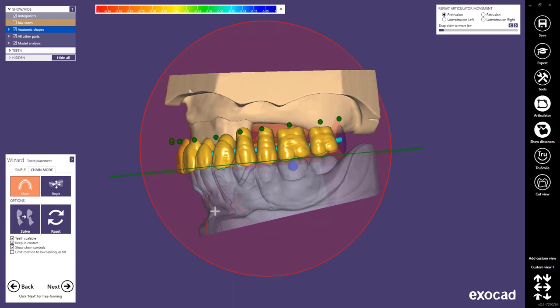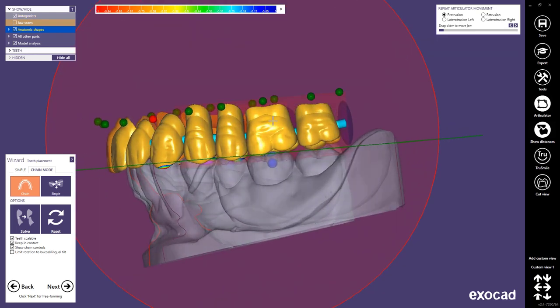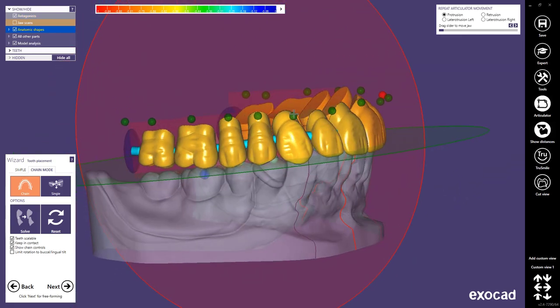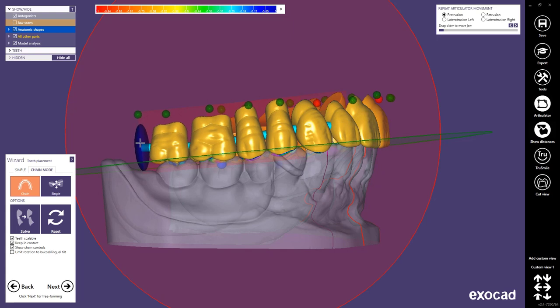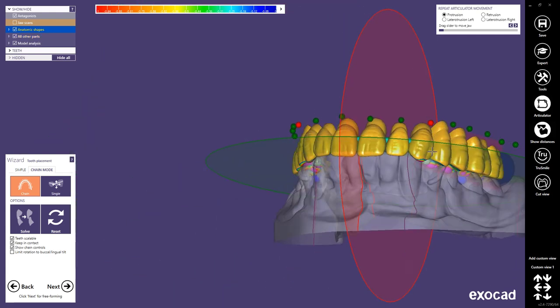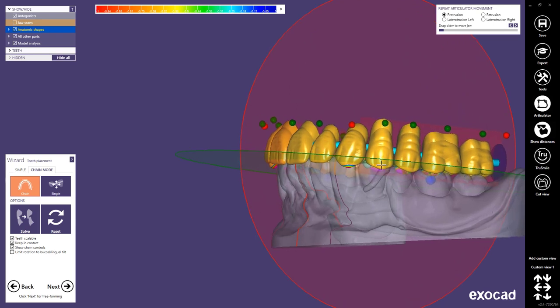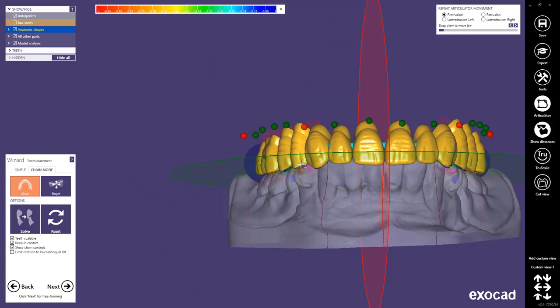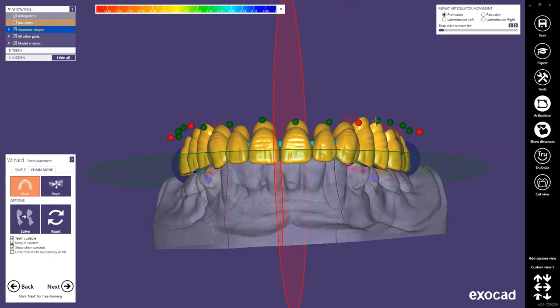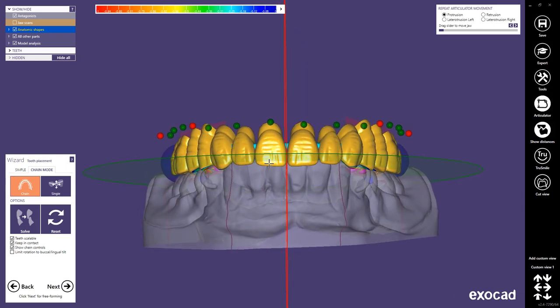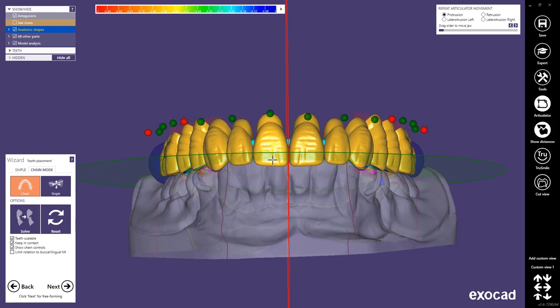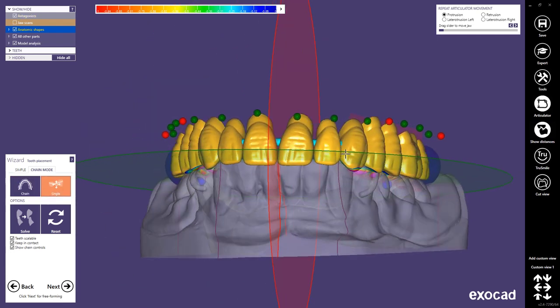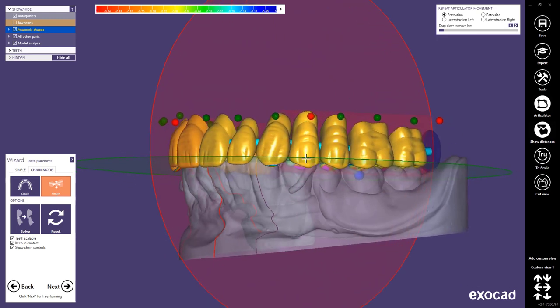For single arch dentures in the tooth placement step you always start off in the chain mode, which makes sense because you have to move around a lot of teeth in regards to each other. For single arch dentures I prefer to first lock the canines and then move the discs at the end of the molars to only adjust and move the complete posterior arch. Then afterwards I lock the discs and move around the premolars and molars to adjust the height and position in regards to the neighboring teeth. Afterwards I lock the first premolars but unlock the canines, giving me control over the anterior teeth. I can move and scale the complete tooth arch for the anterior teeth as one.